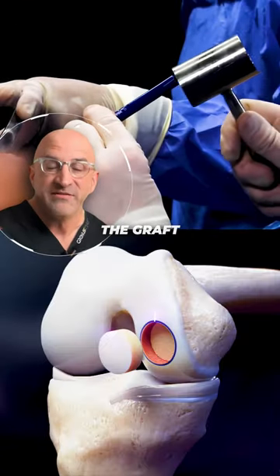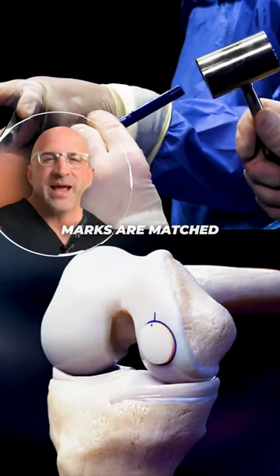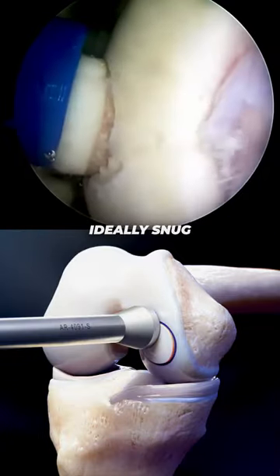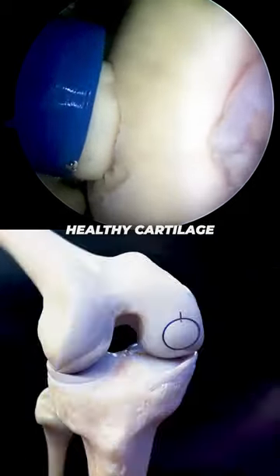Finally, the graft and the socket reference marks are matched and the donor plug is gently pushed into place, ideally snug and flush with the surrounding healthy cartilage.